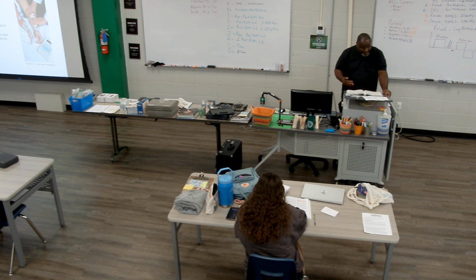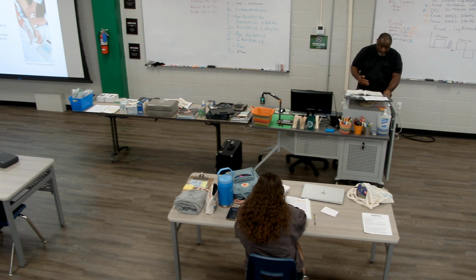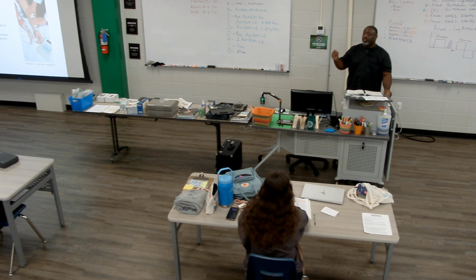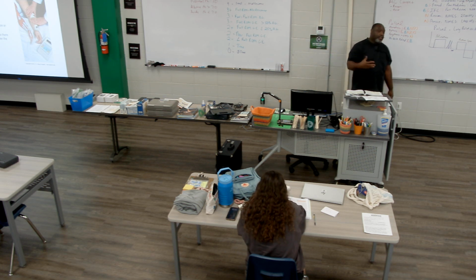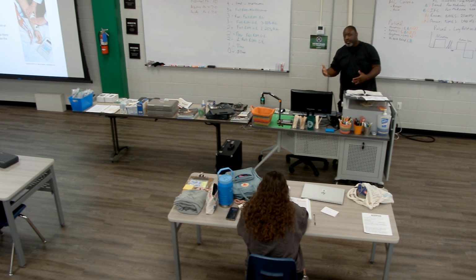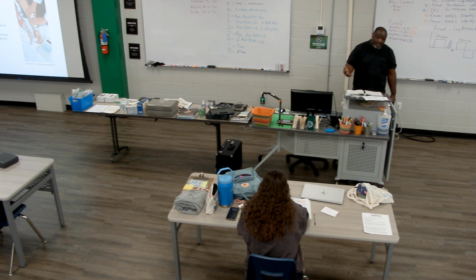It says, because of the augmented passive drug delivery process, iontophoretic applicators or electrodes should remain in place to maximize the amount of transcutaneous drug delivery. So after we do this treatment, we don't just snatch the electrodes off and throw them in the garbage and send the patient on their way. We will ask them to keep the electrodes on for a period of time, because it's going to enhance drug delivery passively even after we've done the iontophoresis device. So that's the goal.